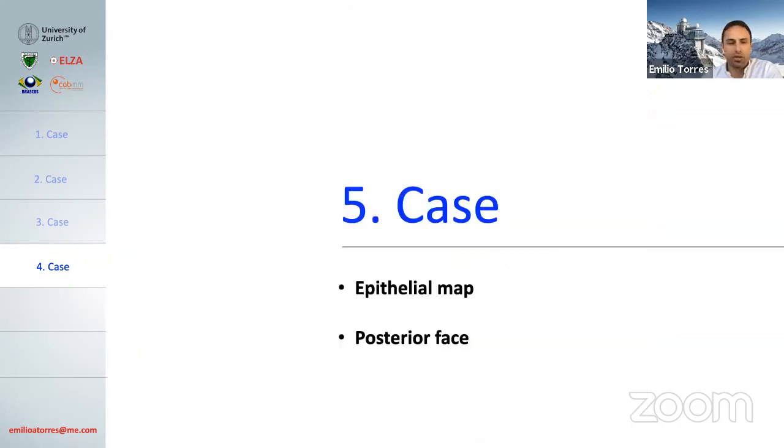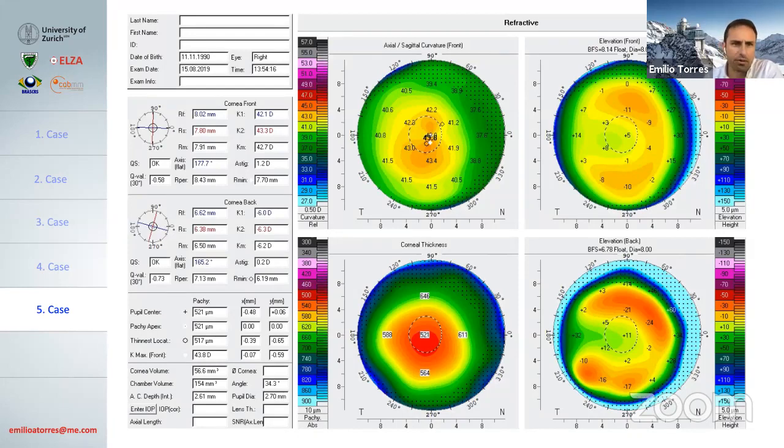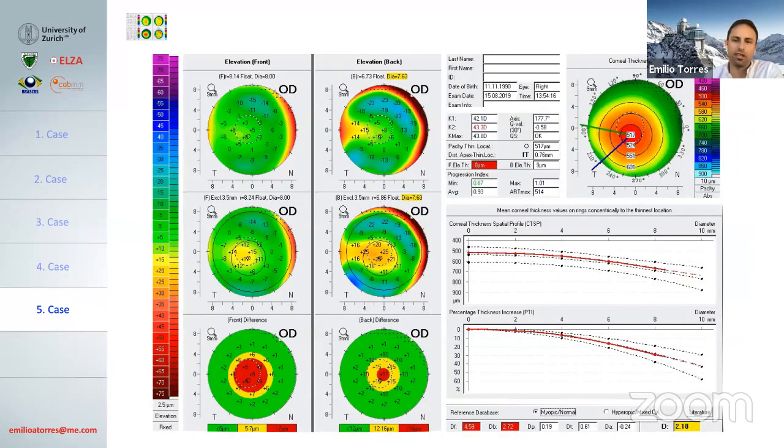And finally, a curious case also regarding the use of epithelial map in keratoconus. A patient with a topography that had a very high asphericity, as you can see, minus 0.58 in Scheimpflug, and the bow tie was a bit truncated. There was a superior-inferior difference of around 1.5 diopters in the central area, and the patient had a completely abnormal BAD-D. Some would say the cutoff would be over 1.2 or 1.6, depending on the sensitivity and the specificity. Here, the patient had 2.18, so completely abnormal. And also biomechanical parameters, completely abnormal.